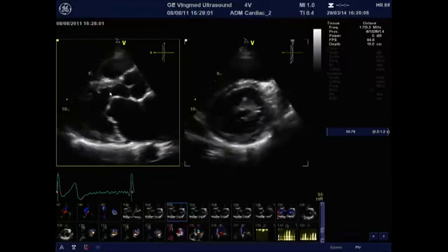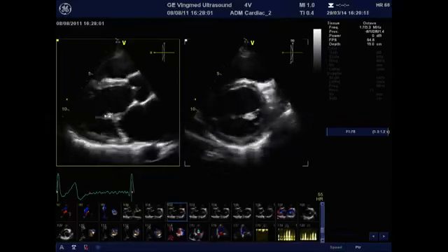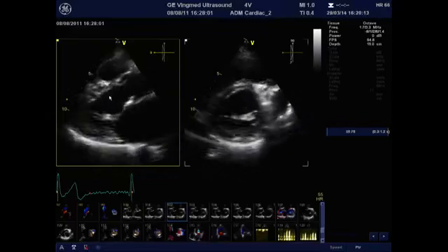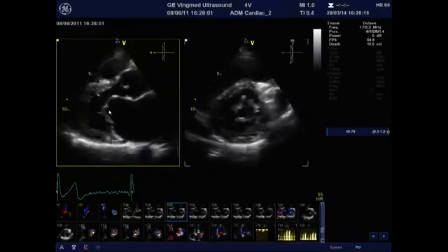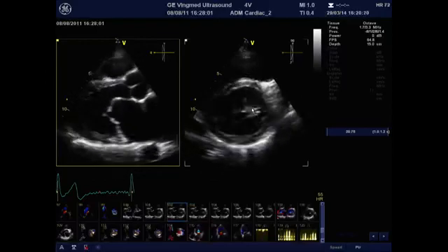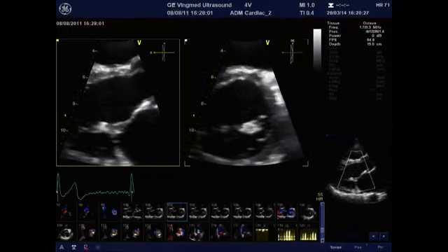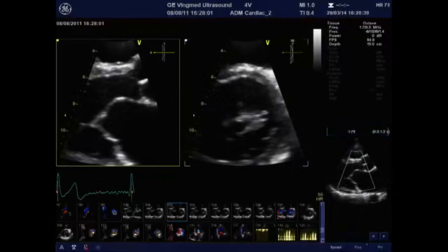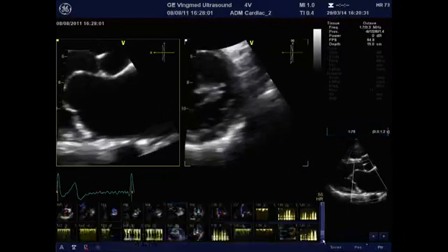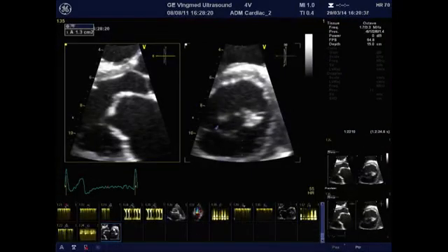I have an image like this, and I can freely move the sagittal plane from the left ventricular apex to the base of the mitral leaflets, to the level of the smallest visible orifice, to have in this image the smallest orifice available. You can just zoom the image, freeze, and do your tracing. And as I did in this patient, there is a mitral valve area of 1.3 centimeters square, which is totally concordant with what we were measuring earlier.